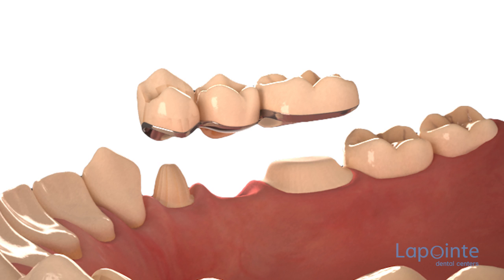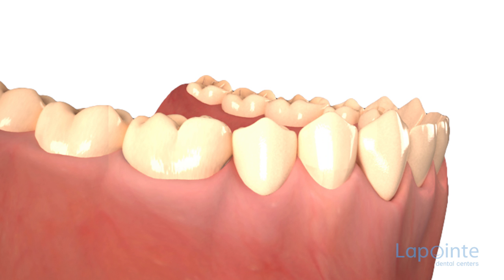Another type of bridge is the fixed bridge. This one can replace more than one tooth and is fixed onto a minimum of two crowns on solid teeth that are called an abutment. This type of bridge requires grinding of the pillar teeth.